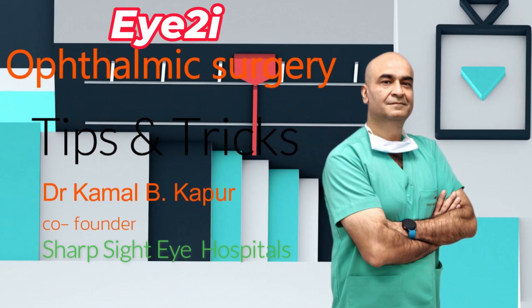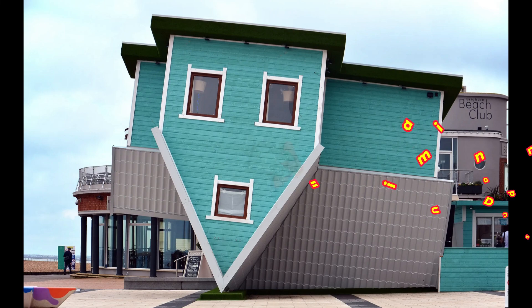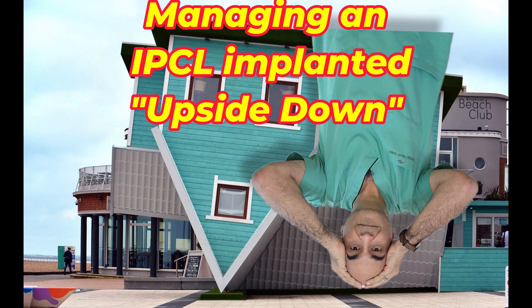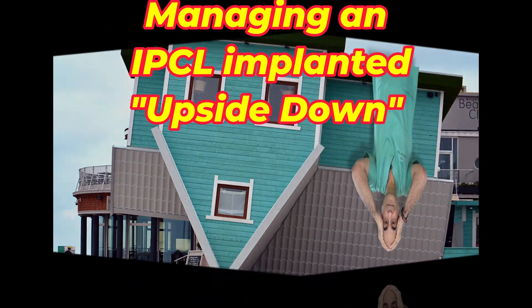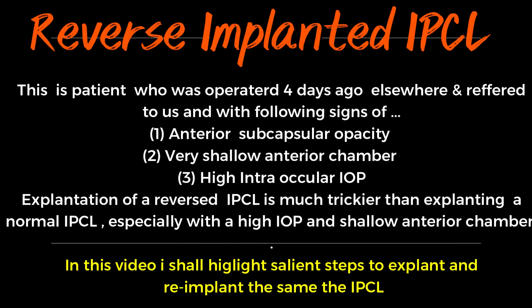This is an interesting situation where a patient who was operated four days ago and implanted with an IPCL which was upside down and reversed was sent to me for explantation. This patient has an anterior subcapsular opacity, high intraocular pressure, and a very shallow anterior chamber in the periphery.